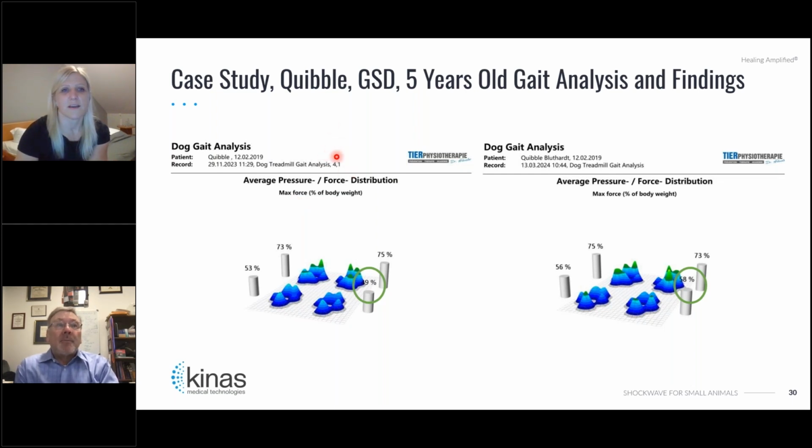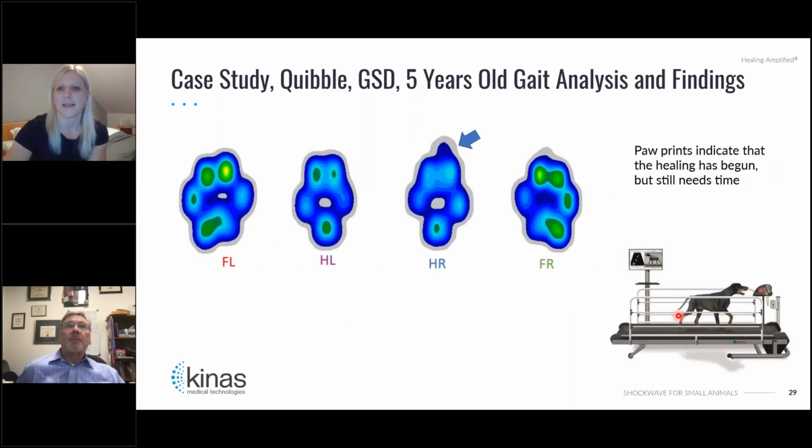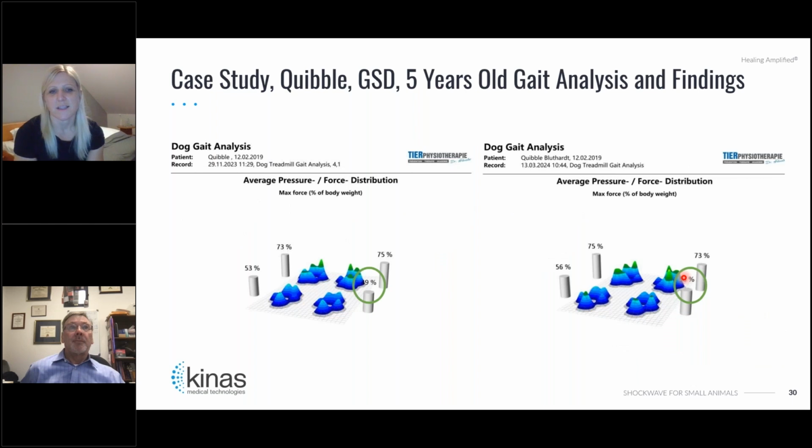We always make sure that we have the dog walk at the same speed so we can compare those forces. It's a treadmill we have the dogs walk on, so that's what it looks like down here. We especially use the treadmill because that's how we can make sure that they always walk at the same speed. And the speed we choose for the follow-ups is the exact speed we would choose for the initial, so we can compare it exactly to each other. Because speed makes a difference. There's more force produced the faster they walk, so it would look different in a trot, but this exactly is a walk in a dog. It's at 4.1 kilometers per hour.